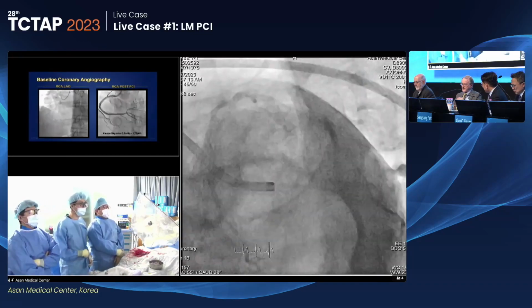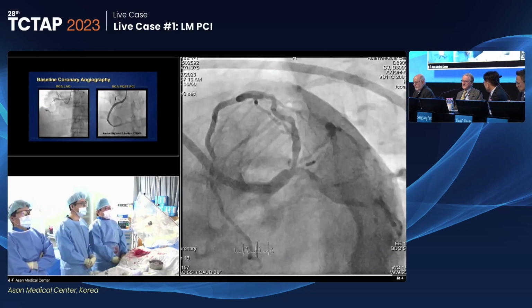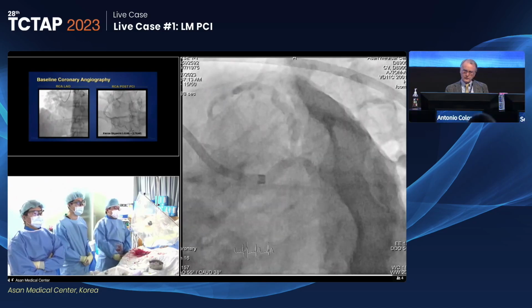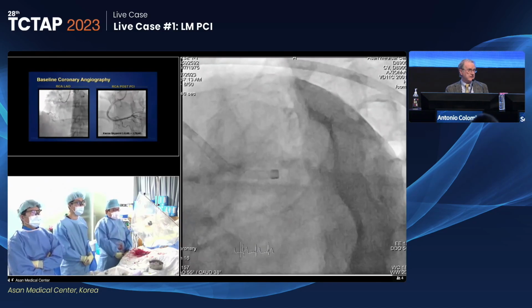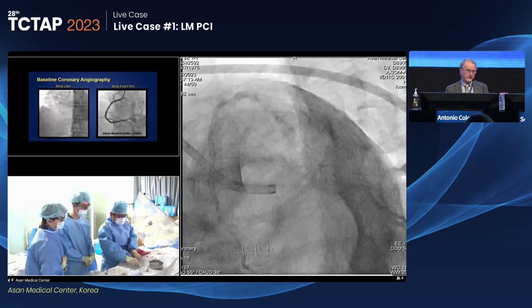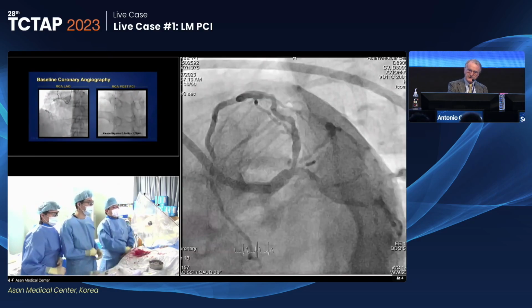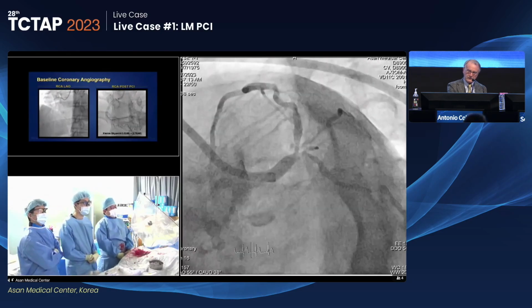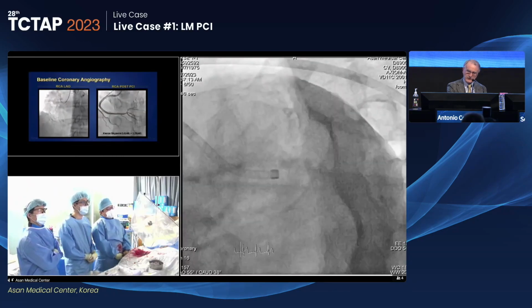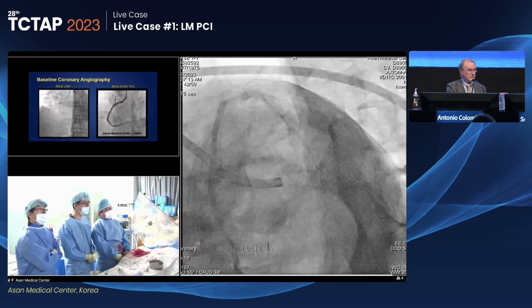Yeah, of course he's a good candidate for surgery, but if you have already opened the right coronary artery, it means that you've decided not to do surgery. But you can also do surgery after opening the right coronary artery. You can do 2 arterial grafts on the left and the stents on the right, so it's okay. But I think he's also a good candidate for PCI because the vessels are big. The left main can be done with 1 stent. I don't think you need 2 stents here. So it's very reasonable to do PCI as well.